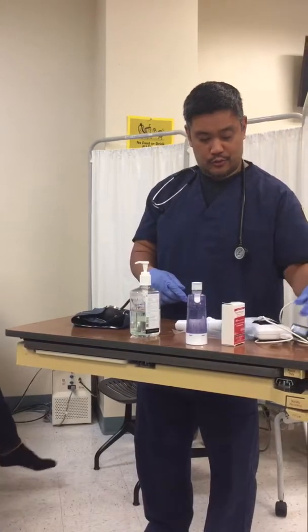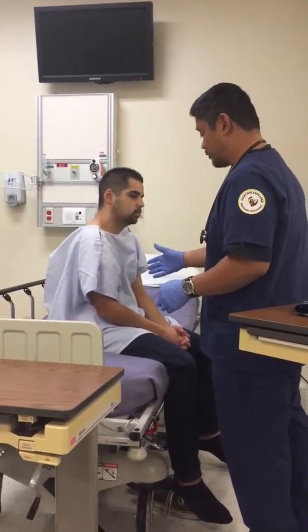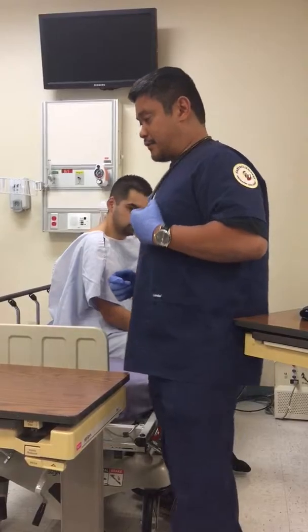So I'm going to be listening to your lungs. I'm going to start from the back, if that's all right. And I'll also be listening to your front. Okay. So I'm going to go right behind there.